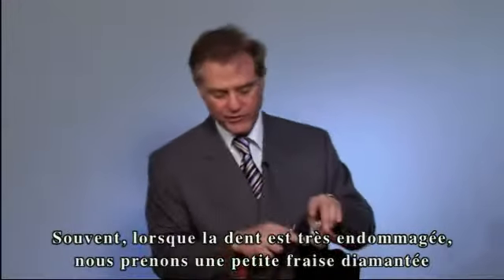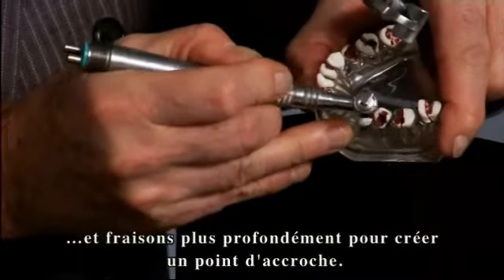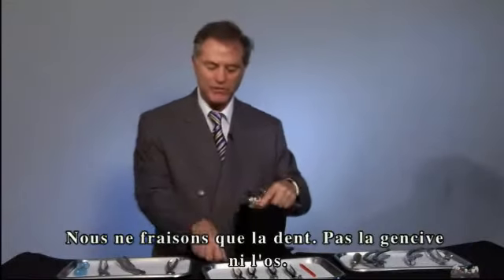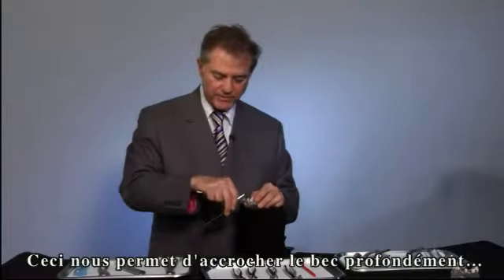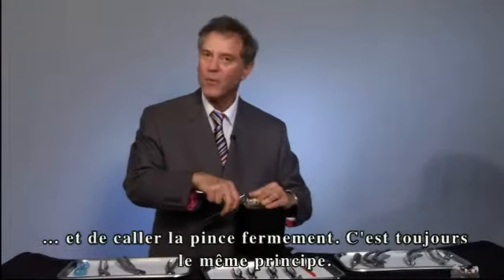Many times, if the tooth is completely rotted, what we do is take a little diamond and go farther down to create a purchase point. All we're doing is removing tooth surface only — not gum and not bone. This allows us to push the beak down a little farther and lock it on. Same principle: wait.